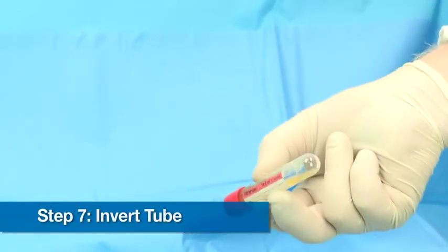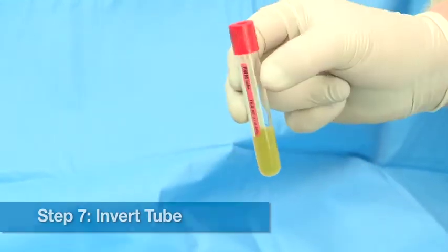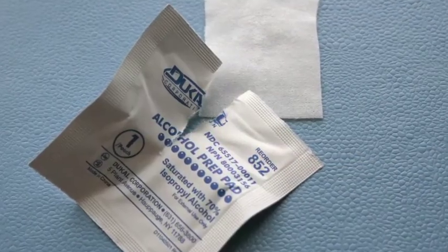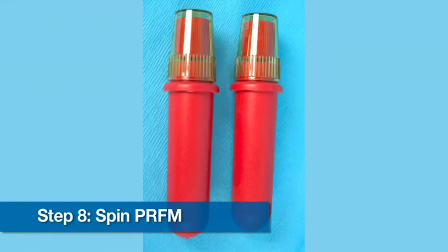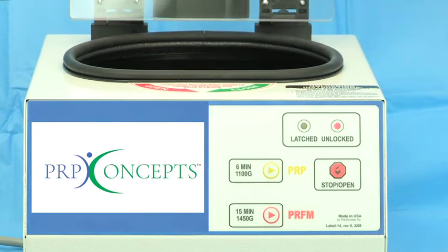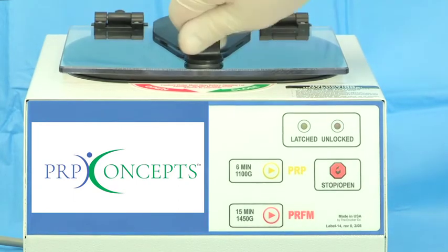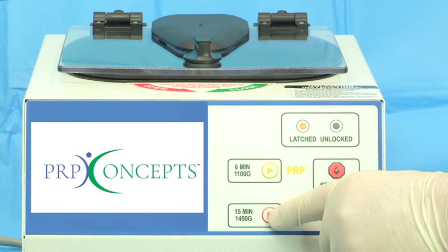Invert tubes 7 times to mix calcium chloride with PRP. Wipe tops with clean alcohol swab. Place red Prfm tubes into individual tube holders, placing caps on top, and into centrifuge. Lock the lid. Spin for 15 minutes at 1450 RCF.